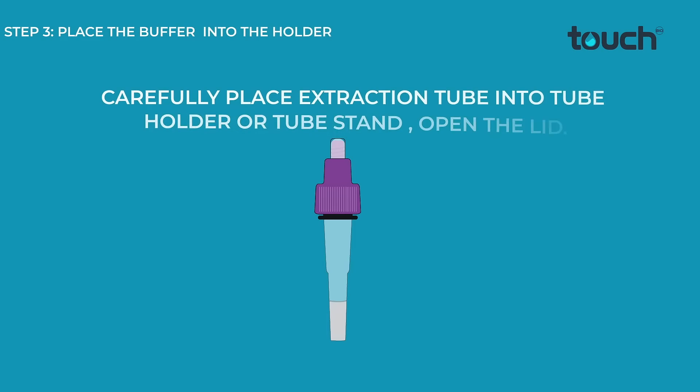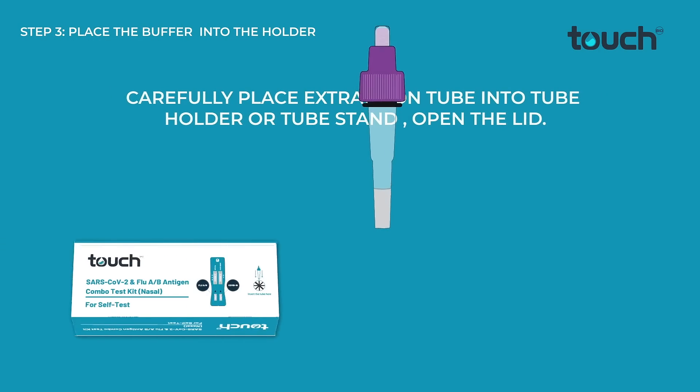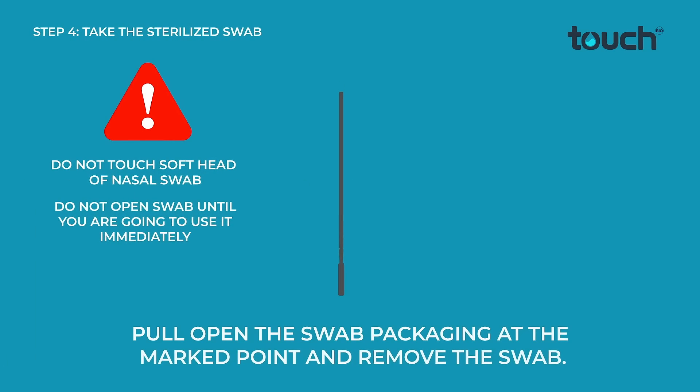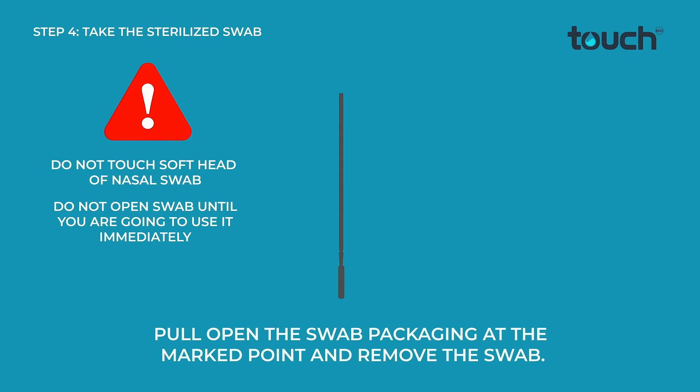Carefully place the extraction tube into the tube holder or tube stand and open the lid. Pull open the swab packaging at the marked point and remove the swab.